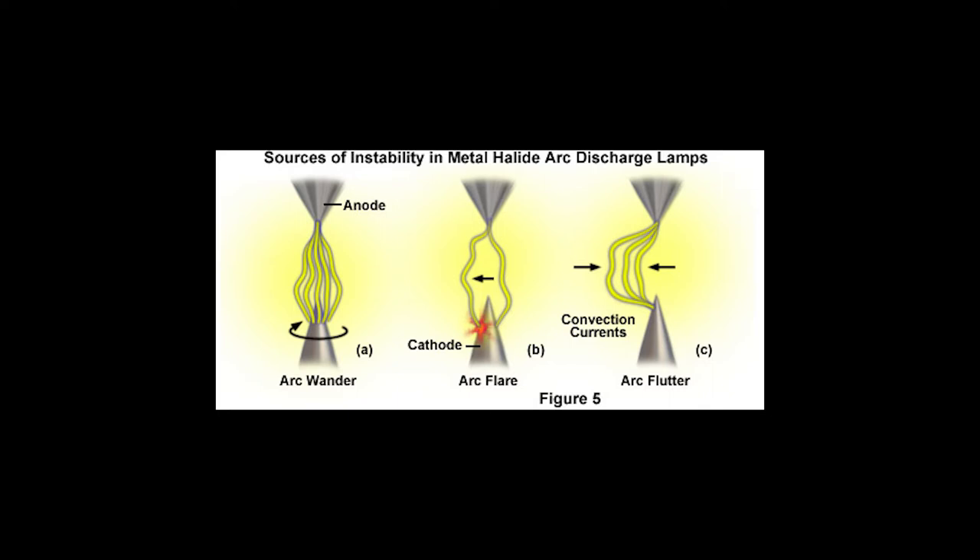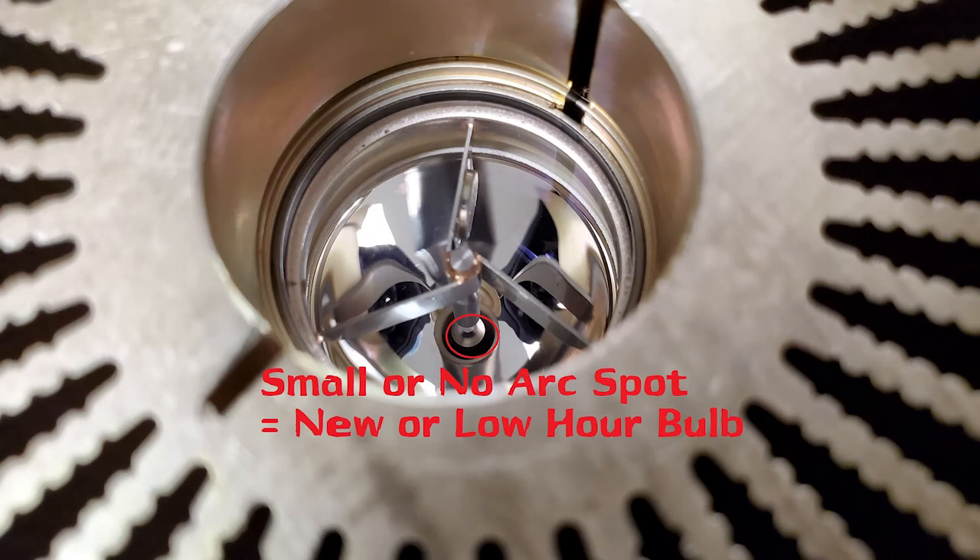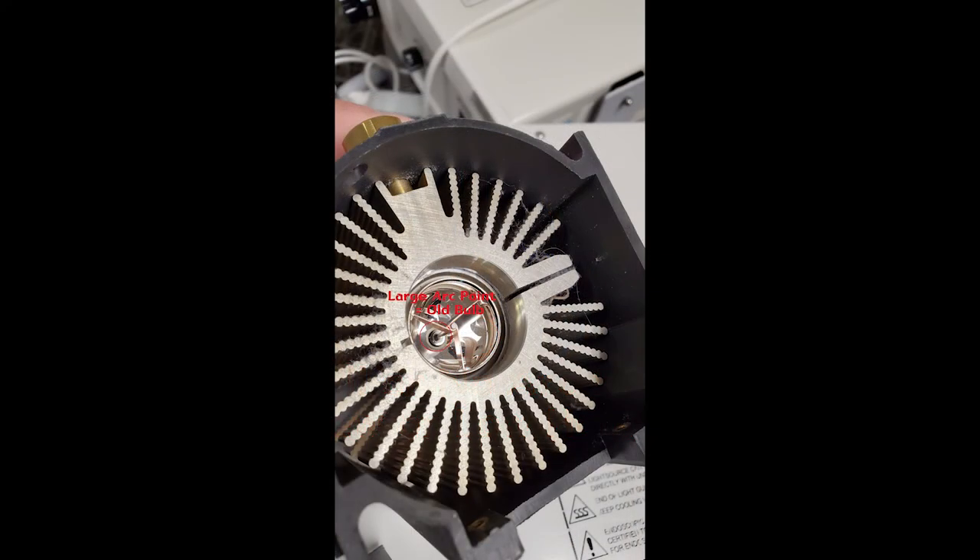Surgeons will often complain that the lamp is either not bright enough or appears to be flashing. On a new bulb, there's almost an indistinguishable hot spot or arc spot between the cathode and anode. You can pick up a lamp during a PM, look at the anode and cathode, and if you see almost no hot spot there, that means it's probably a low-hour or brand new bulb. On an older bulb, the dark spot between the anode and cathode is noticeably larger.